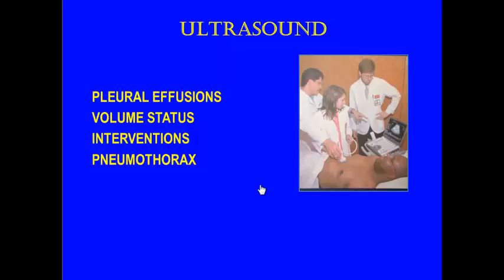evaluate the IVC and cardiac activities. We can direct some interventions, and in the ICU, the pulmonary folks can evaluate for small pneumothoraces at the bedside, something that radiology we don't do since we've got the X-ray handy, but there is a way to do that at the bedside. What might we see? Well, if we had a chest X-ray and we had this large area of density here, with ultrasound we could see, yes, there's a big large pleural effusion and some atelectatic lung there.